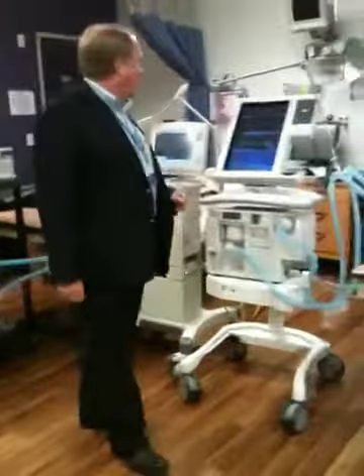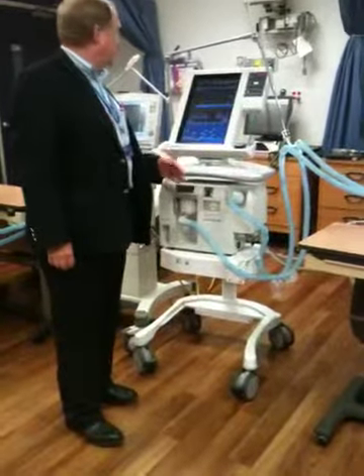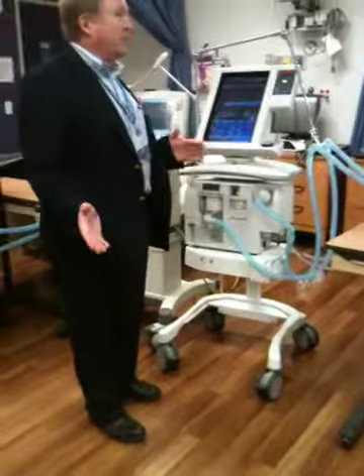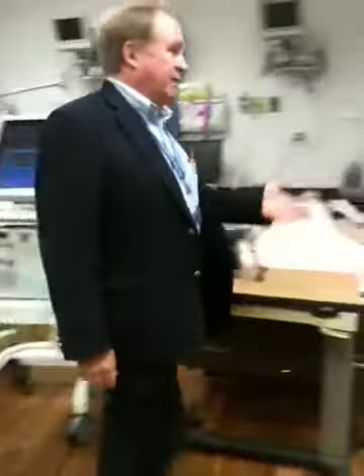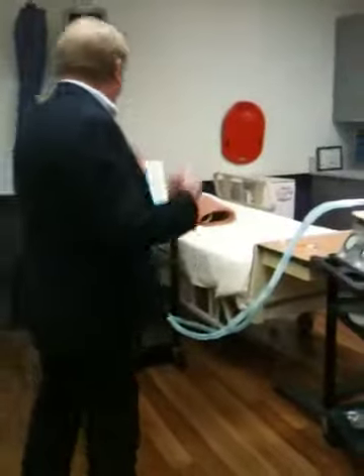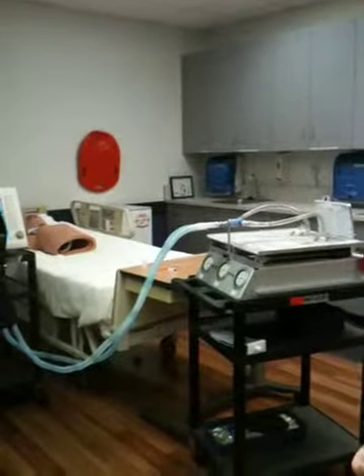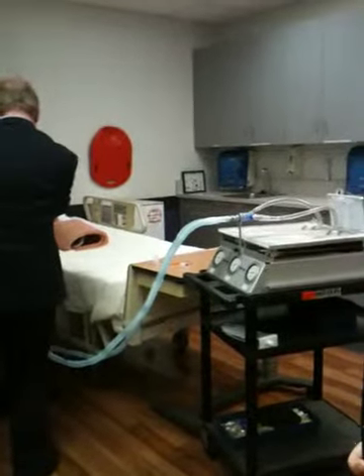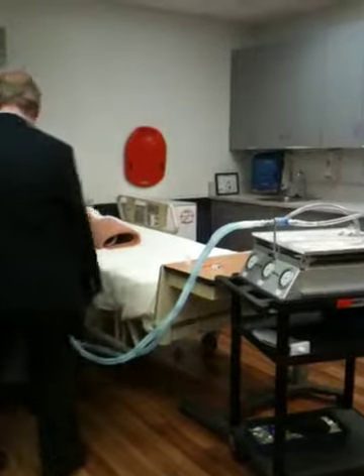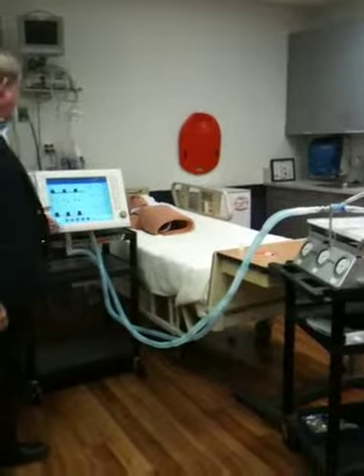But we have all these graphics come into play. Peak, the pressure volume curves, which are a compliance curve. We can do it with a static one where it gradually rises like we do with the Drager. Again, we have our graphics that we're looking at, plus our numbers.